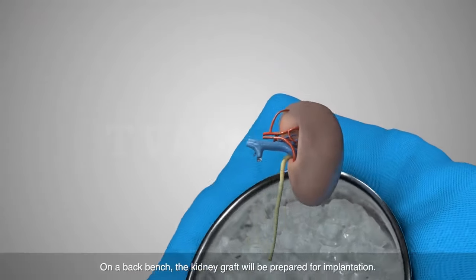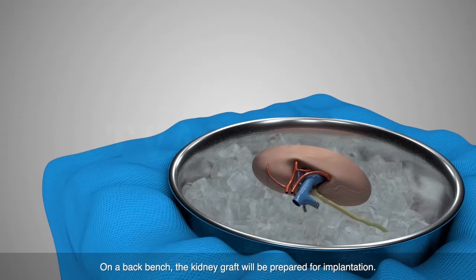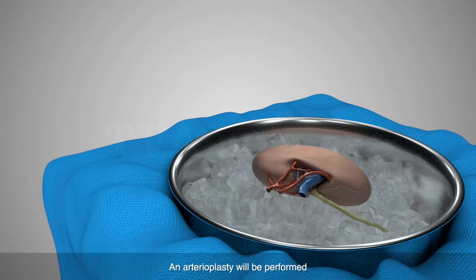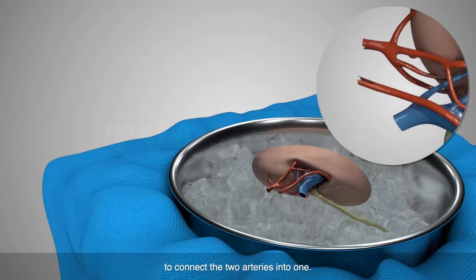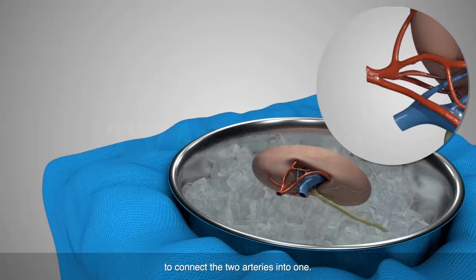On a back bench, the kidney graft will be prepared for implantation. An arterioplasty will be performed to connect the two arteries into one.